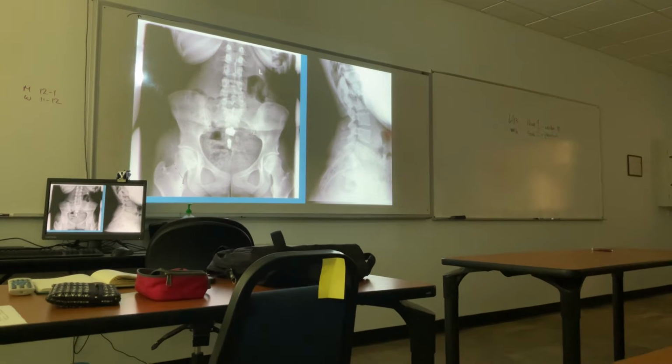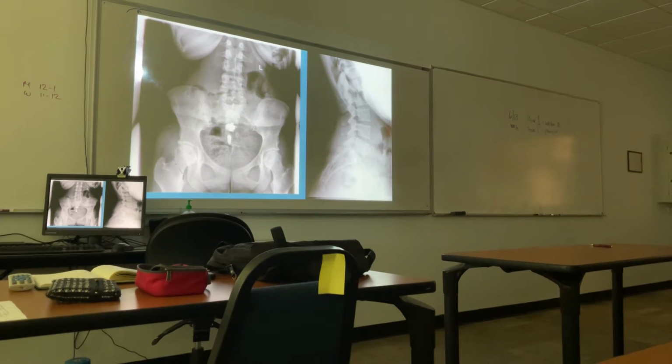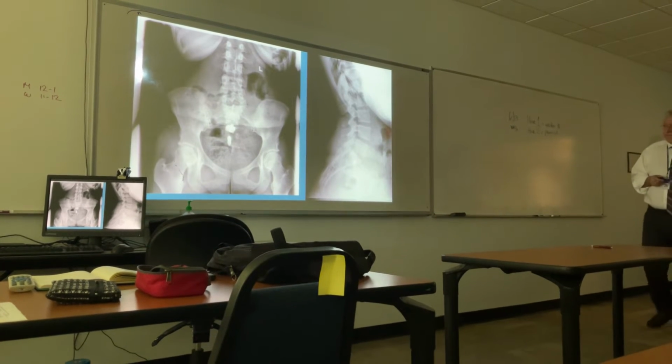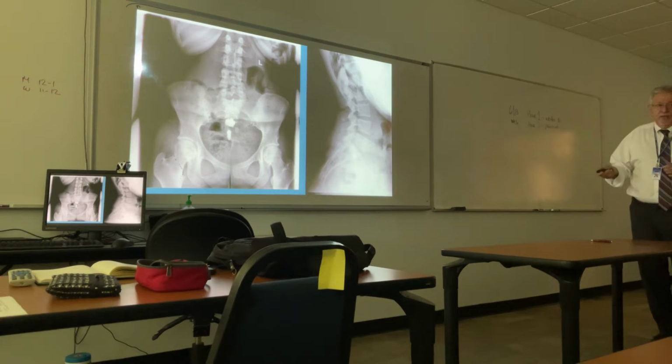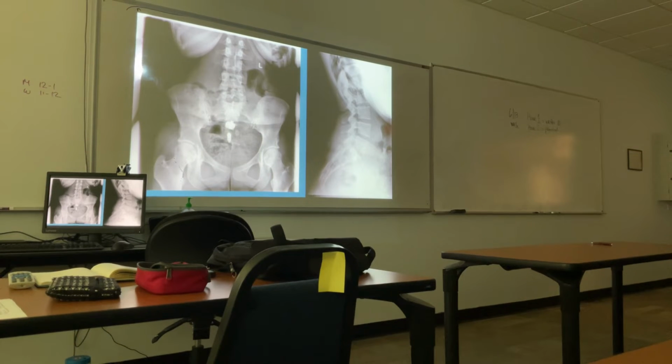Damn. What is damn? They messed up their sacrum, so they had to go in and... The sacrum is normal, is it? Yes, it is. Keep looking. Calcification somewhere. They have an IUD, good. How did you know that's an IUD? I had a lesson about IUDs this morning, okay?